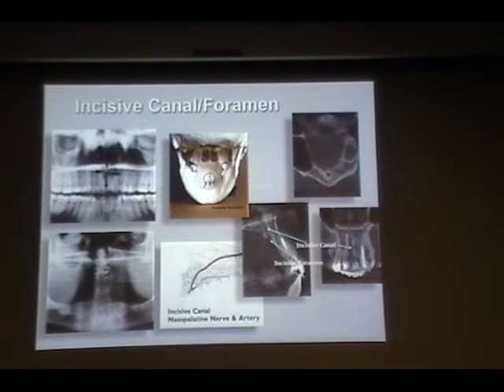The other structure that I would like to highlight in this particular slide is the incisive canal or incisive foramina, also called nasopalatine duct or foramina. It has got a rail track kind of appearance. You can see the corrugated border like this one and like this one in between tooth number 8 and 9. So generally they are pretty straight like this.